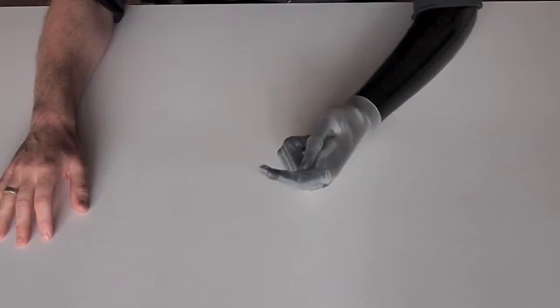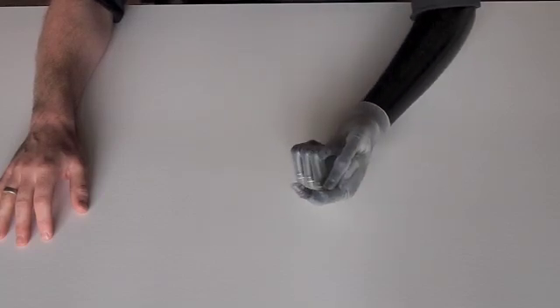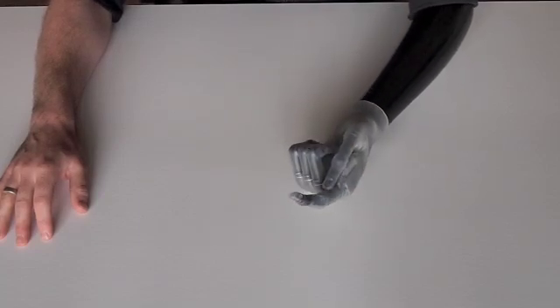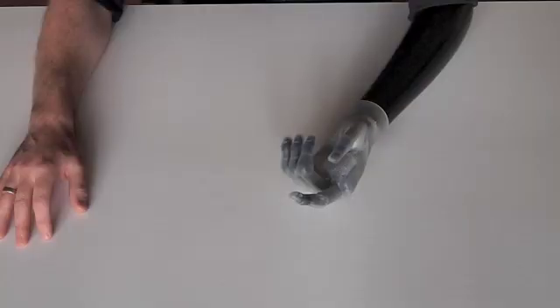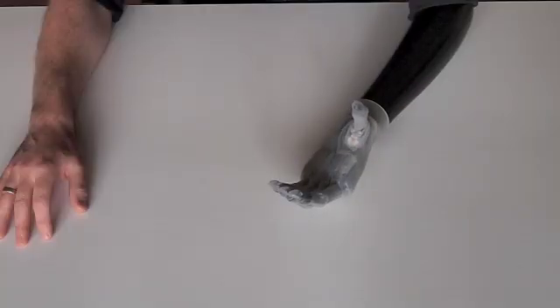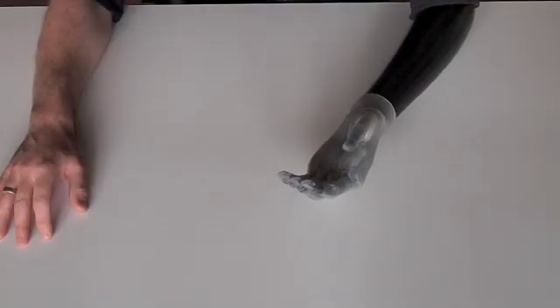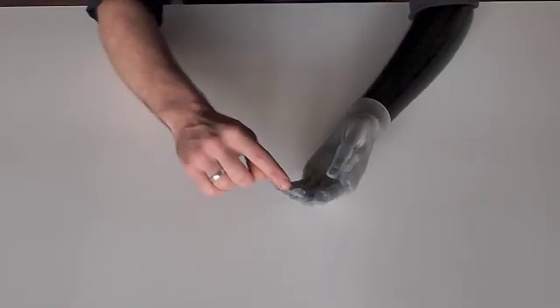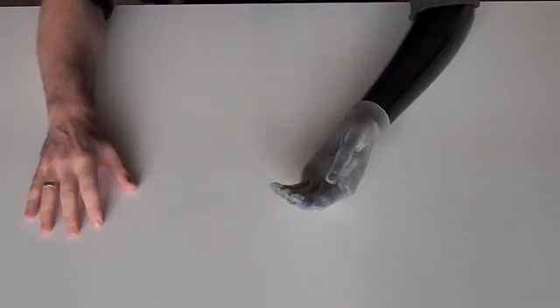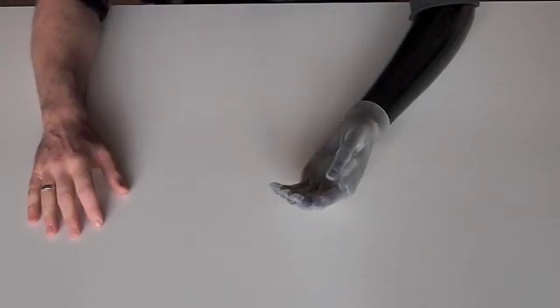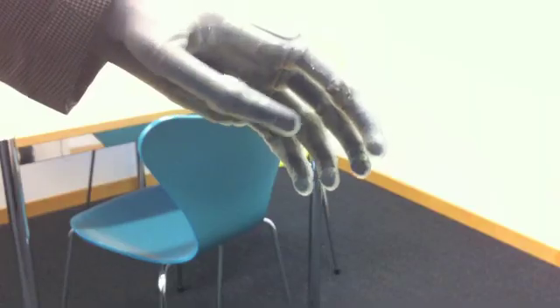My fourth grip mode is called thumb tuck. I activate it with an open signal that lasts more than two seconds. The hand then tucks the four fingers and only moves the thumb. This is very useful for donning and doffing clothing.